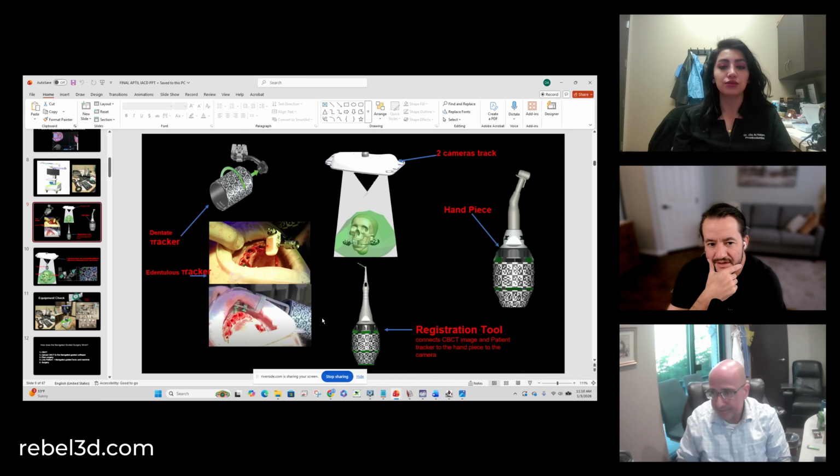So many different advantages. Why better prosthetic function? Because you can actually see the overlaid pre-op STL to the wax-up STL. So you're seeing exactly, not just in real time where you're going drilling, but also, as Dr. Iskandar is saying, you can adjust your plan on the fly, you can still correlate it to the prosthetic plan.